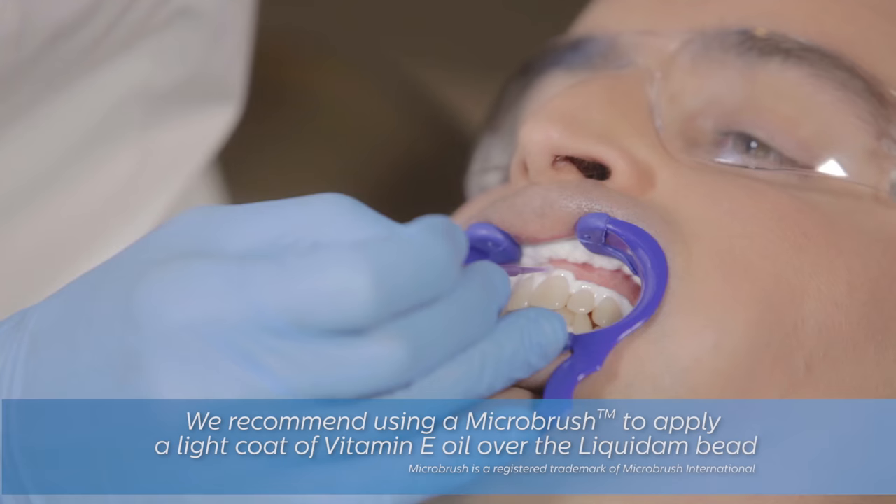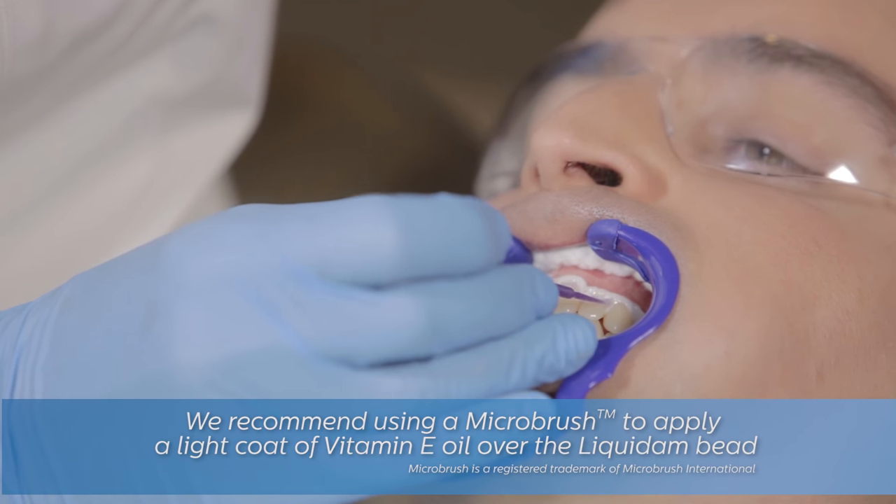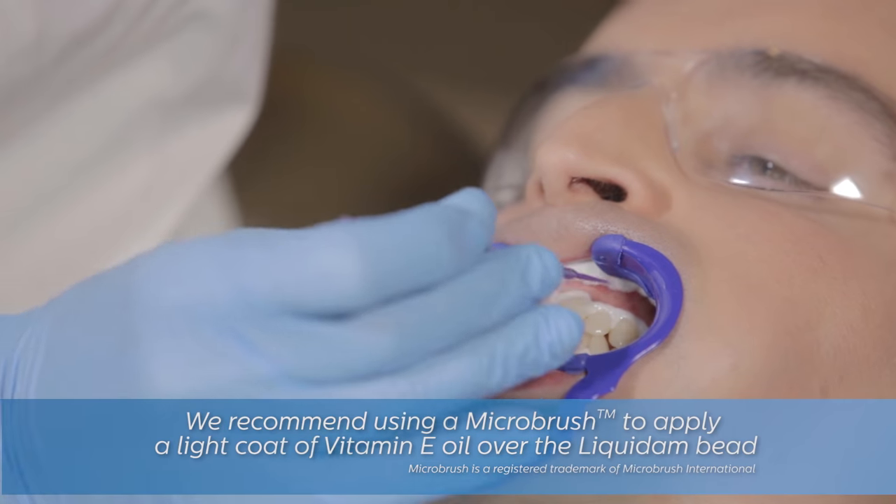Next, apply a light coat of vitamin E over the Liquidam, taking care to avoid getting the oil on the teeth.